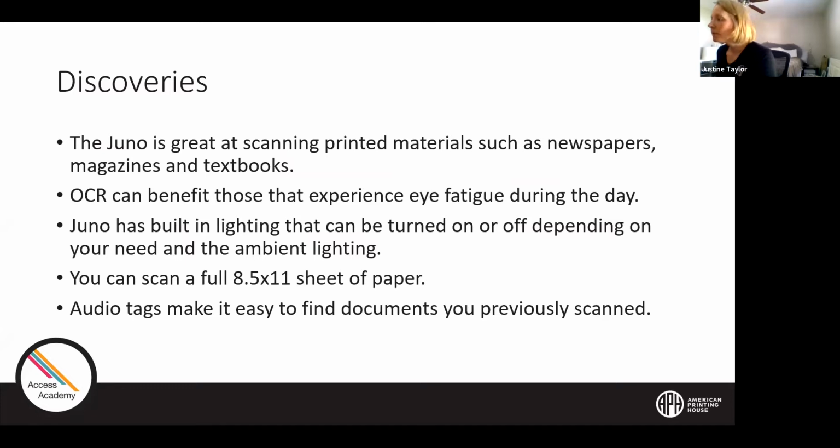Audio tags make it easy to find documents you previously scanned. If you're not going to be transferring these to the computer, the best way to keep track of them on the Juno is through those audio tags. Do you want to check on the poll before we go through the pricing, or answer any other questions before we do that? Yes, let's go to the poll.